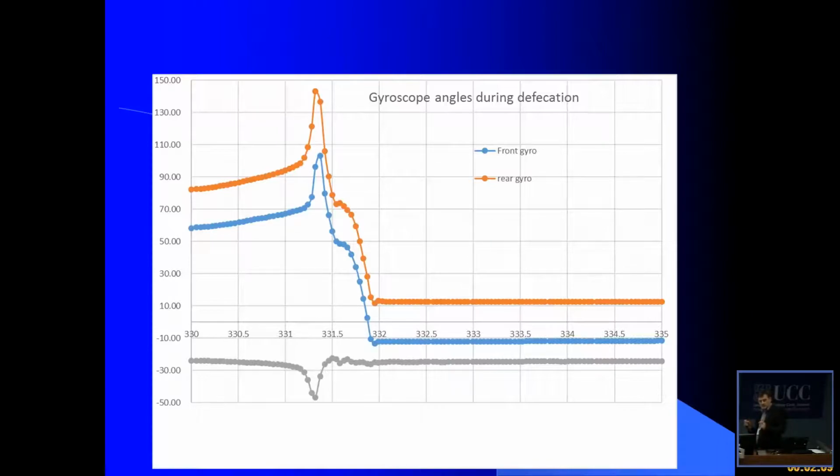And finally, we have 2 gyroscopes in the device, one in each end, and we can use that to measure the angle in the device. As the device slides from the rectum into the anal canal, it has to change orientation. That is also nicely measured by these 2 gyroscopes, so they change direction, and here it's out of the body. And if we again subtract these 2 from each other, we get a measure of the anorectal angle while it passes.